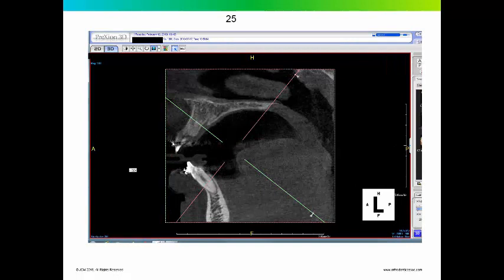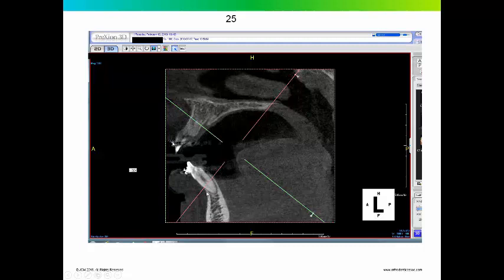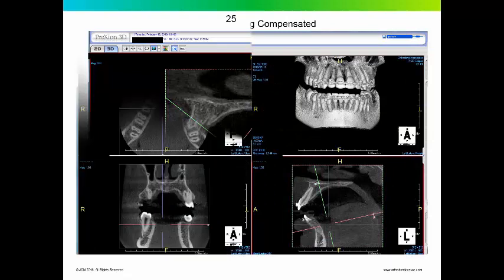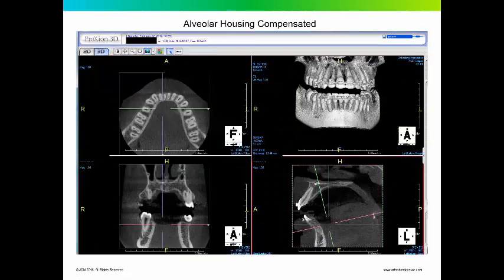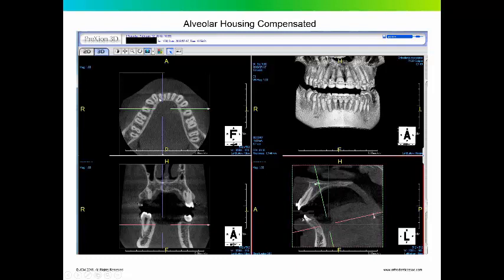And here's tooth 25. You can see tooth 25 still has some lingual cortical plate, but this is approximately where the facial bone or the buccal cortical plate starts as recognized on a cone beam CT. This is a multi-view. It's the axial, coronal, and the sagittal view. This is adjusted to look so that the axial view is aligned with the anatomy of the alveolar housing. In other words, this green line indicates that we're adjusting the axial view to look straight down the alveolar housing. And you can kind of see where this is where we first start to pick up bone at approximately where that red line is, which comports with the axial view.